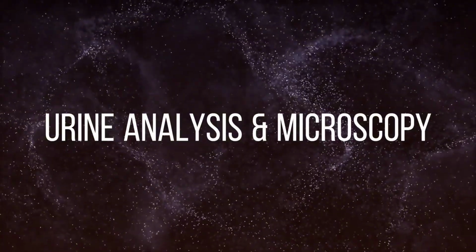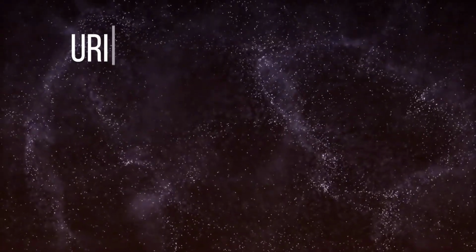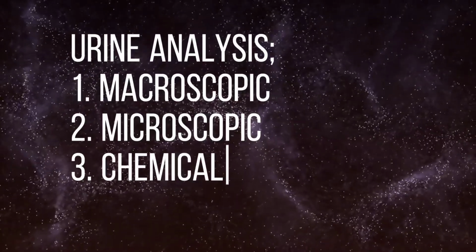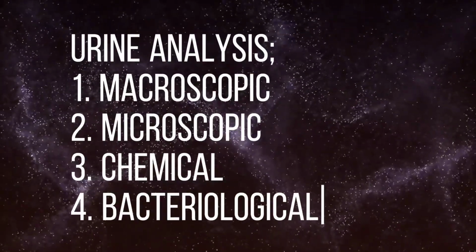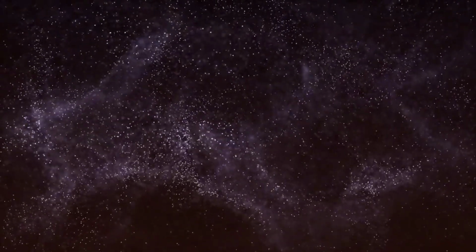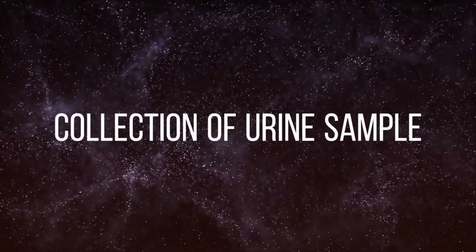Urine analysis and microscopy. The analysis of urine can be divided into 4 main categories. They are macroscopic, microscopic, chemical and bacteriological analysis. Before we get into each analysis, first, we will look at how we collect a sample of urine.